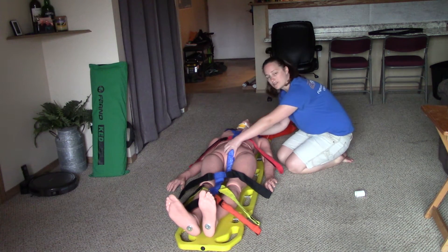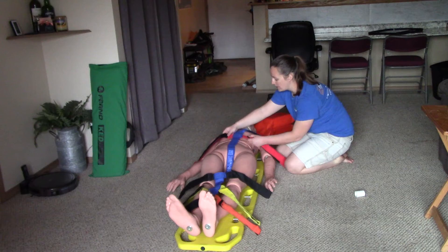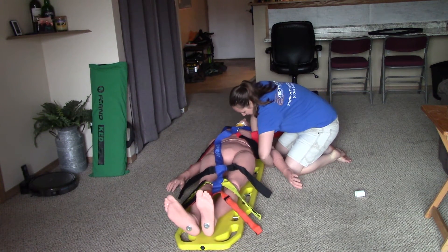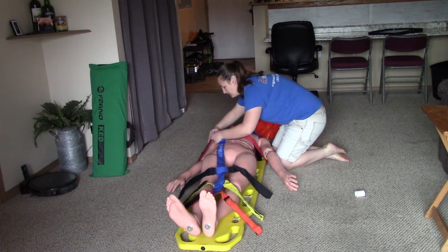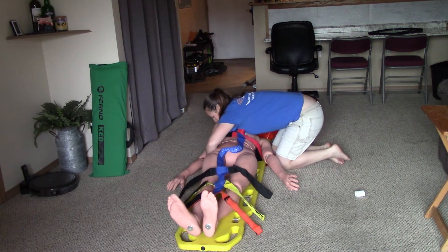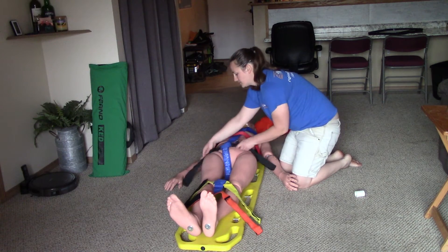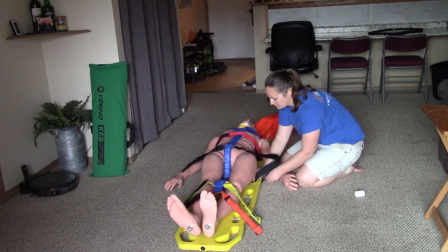The red strap — this was a Y, not an X, so the Y did not cover the rib cage. My red strap I'm going to line up with the rib cage and hook it. We'll come back and tighten all these at the end. My next strap covers the pelvis — going straight across the hips, preferably just below the iliac crest, right across the middle of the pelvis.